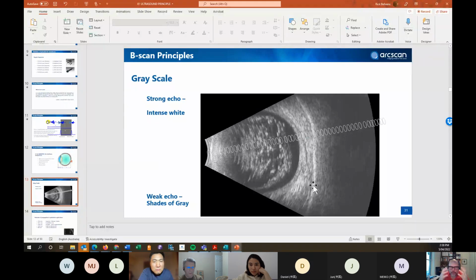So there are like 3 different levels of movement in the base plate inside of the unit. You have one big unit that turns around, and I don't know if you can see my hands, but it does that. There is another movement that is in block, and it moves like that, and then there is another movement that goes like that, which is the probe.